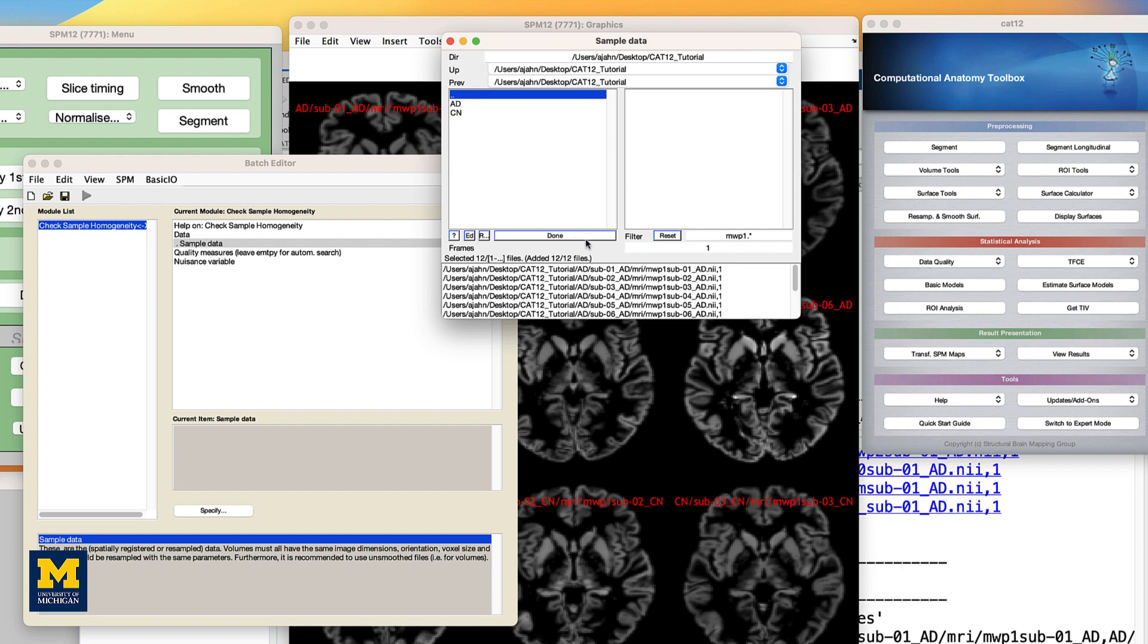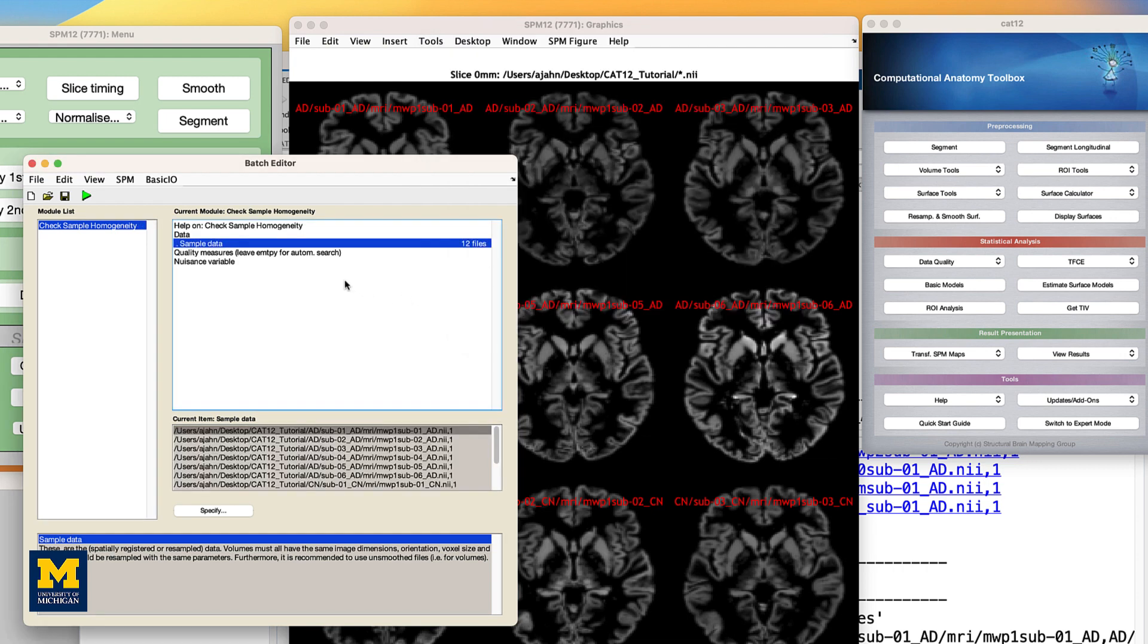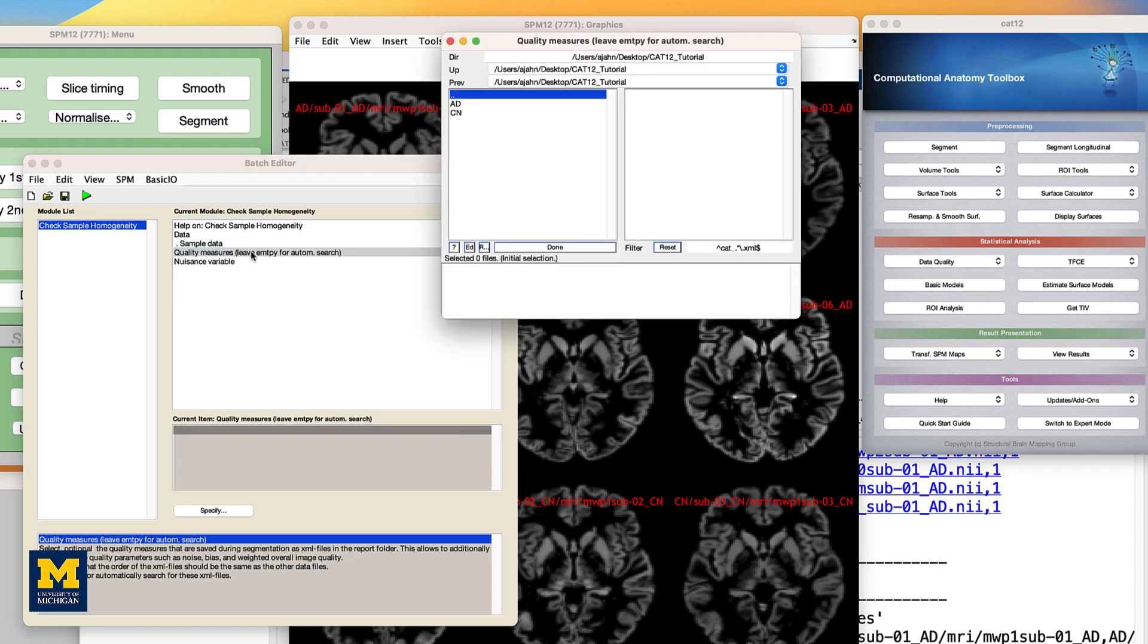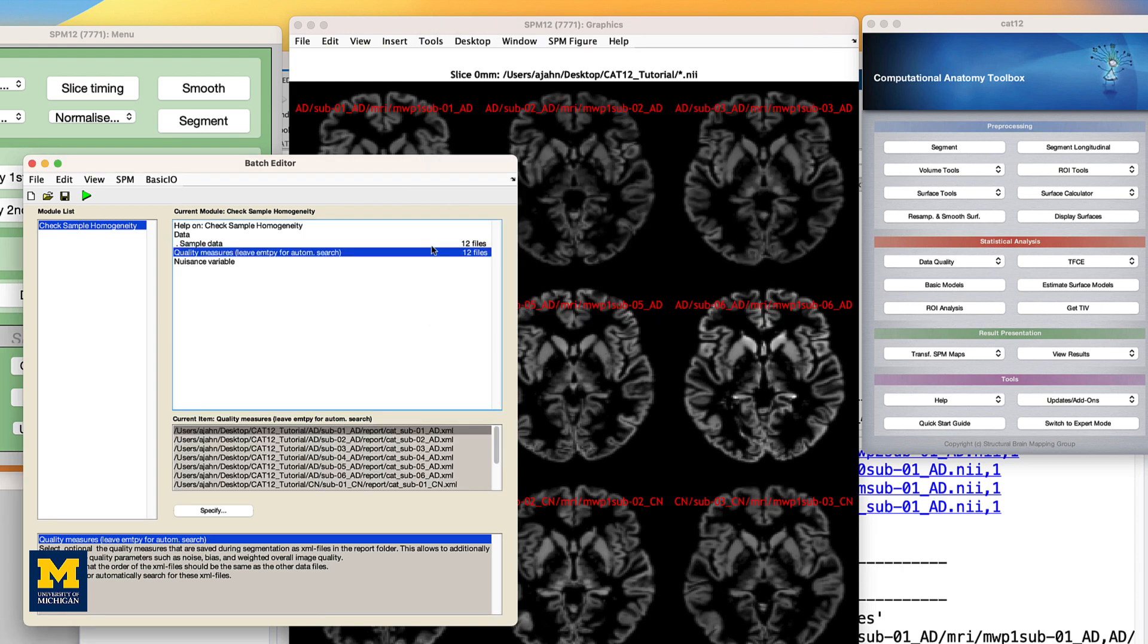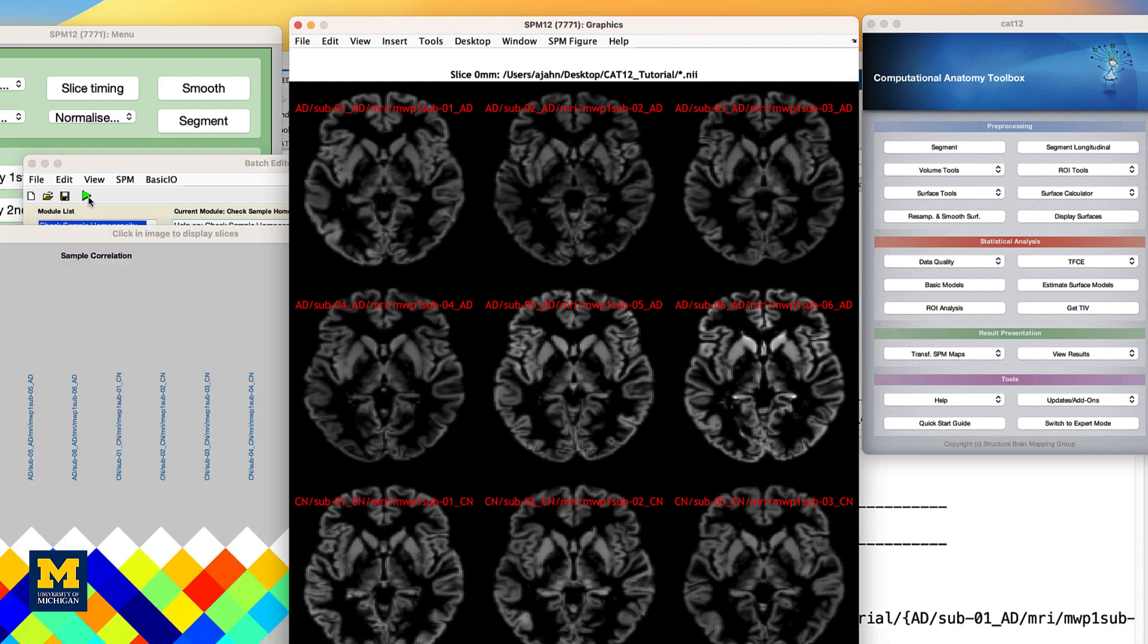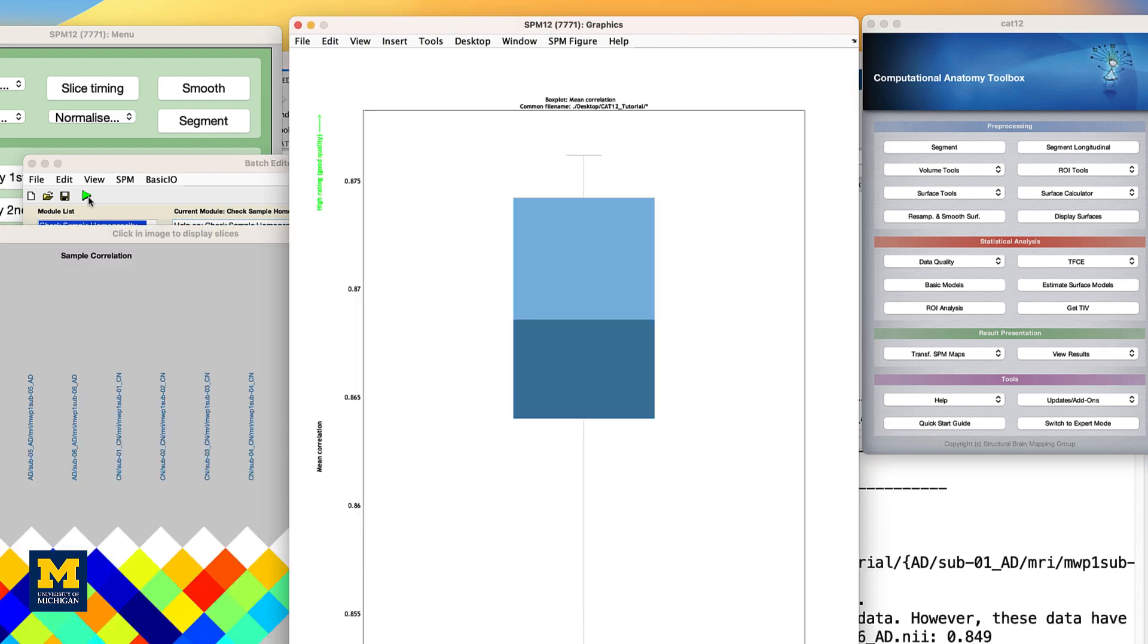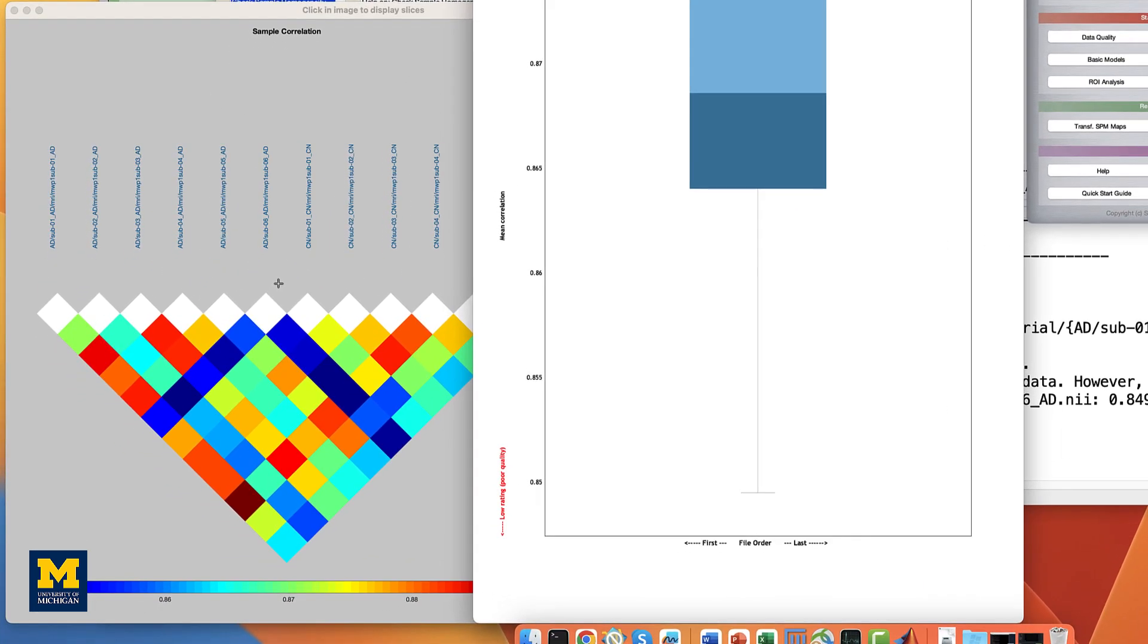Then double-click on the quality measures field. Navigate to the CAT12 tutorial directory, and click the REC button to recursively load each subject's XML file. And then click done. Click the green go button, and you will see both a box plot of every anatomical image's mean correlation with every other anatomical image, and a correlation plot color-coded to show how much each anatomical scan is correlated with every other anatomical scan.